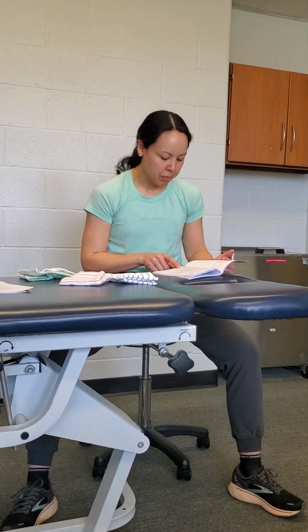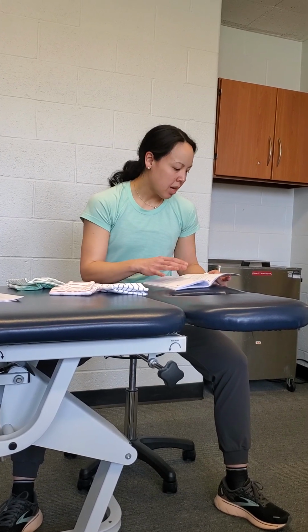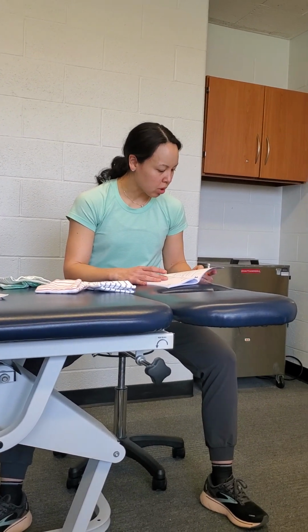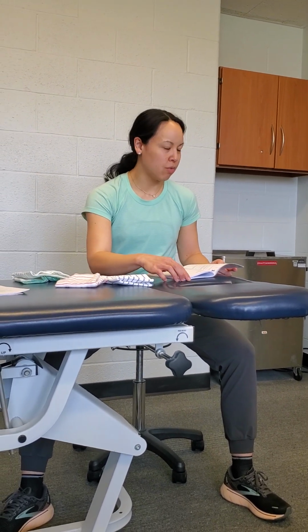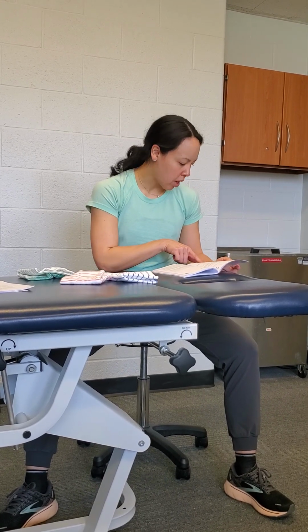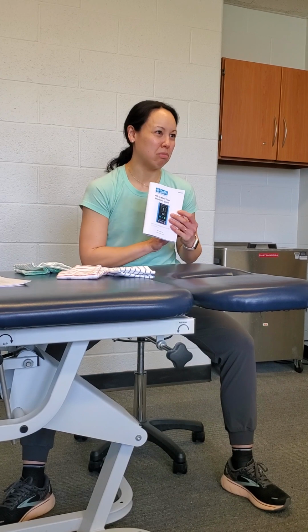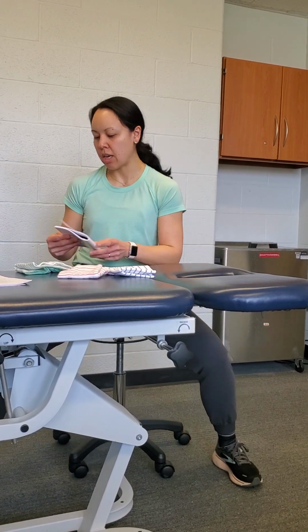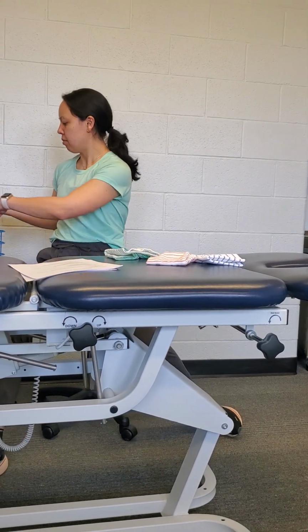So we just want to be cognizant that the patient is stable and safe, right? And then other factors listed are uncontrolled diabetes or sickle cell disease or trait. That's also more in the precautions section versus contraindicated. And then it goes on to list the precautions, and there are also some risk factors that I'll go over as well. But for the most part, this is a nice little reference, and it should just stay with the machine at all times. It also goes over how to use the device, but we'll talk about that today.